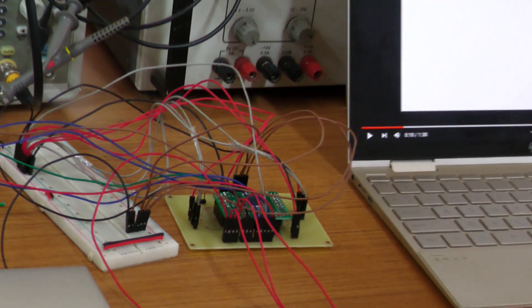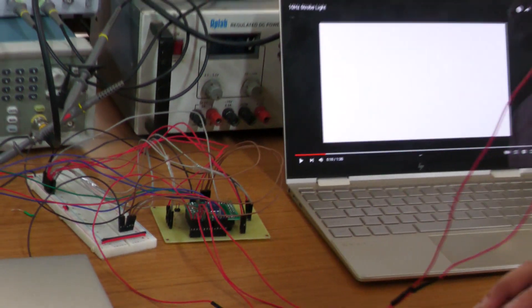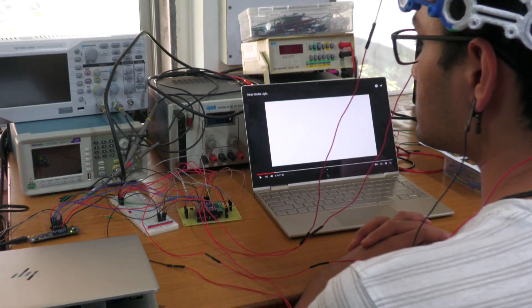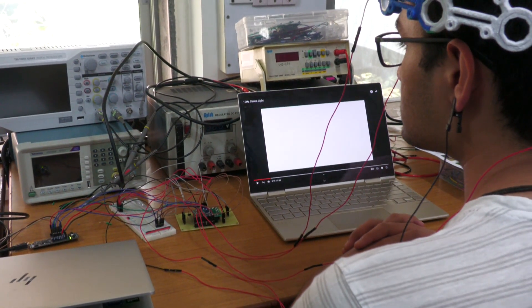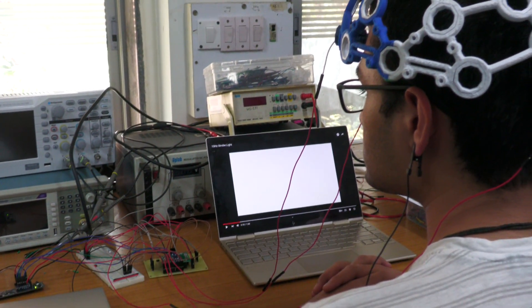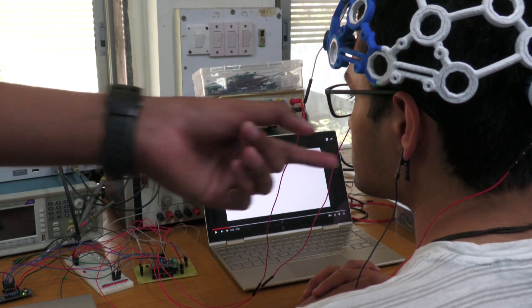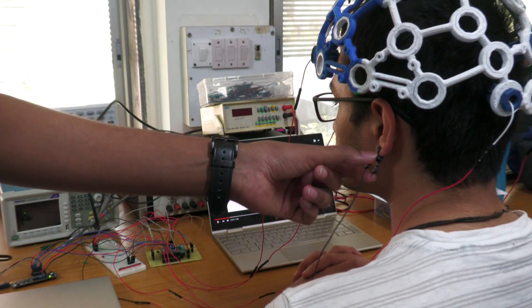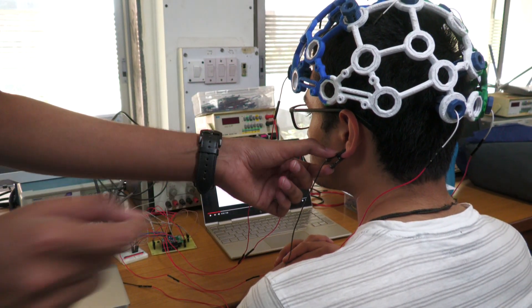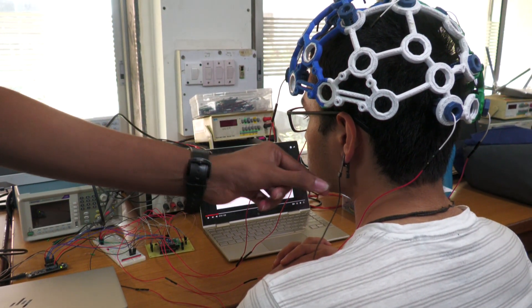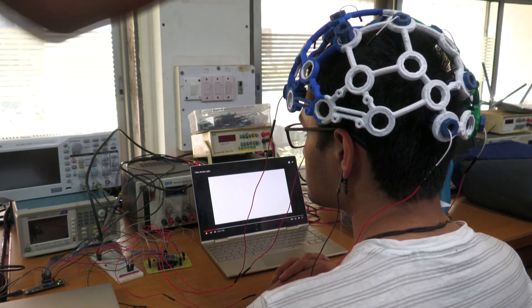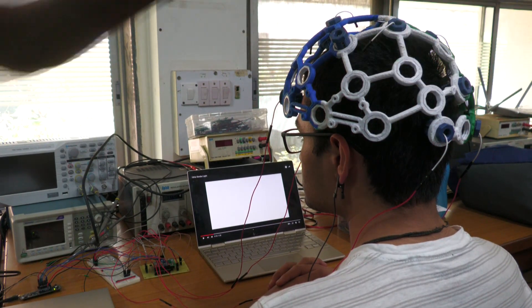The electrodes placed on the headgear are single-ended electrodes and therefore to provide a reference signal for the electrodes, we have attached an ear clip which gives the body potential as a reference signal and this acts as a reference to all four electrode signals.